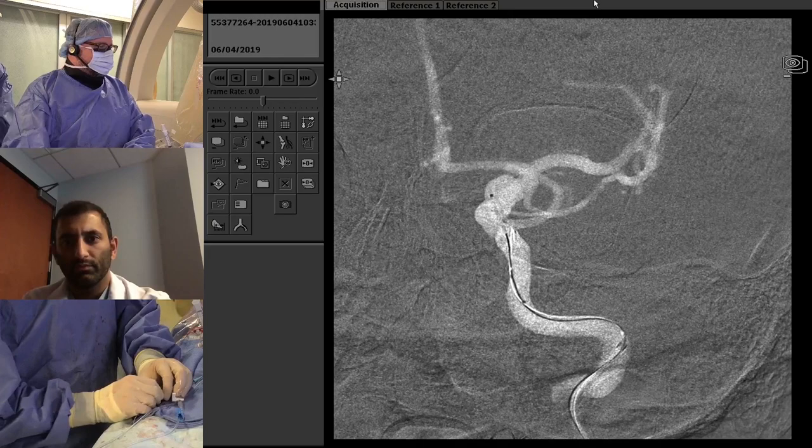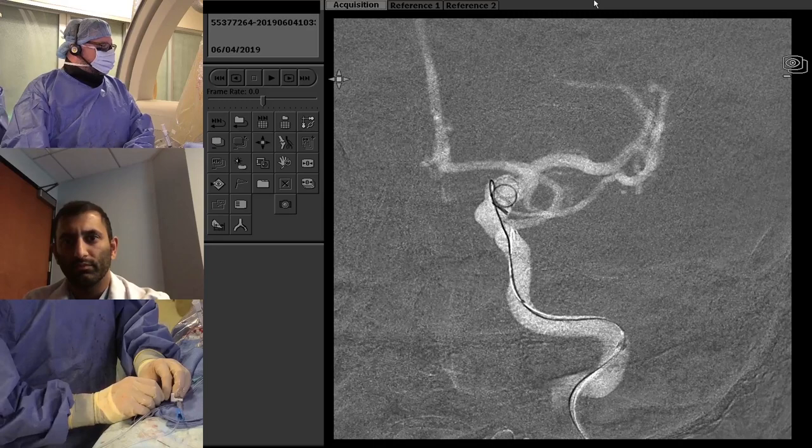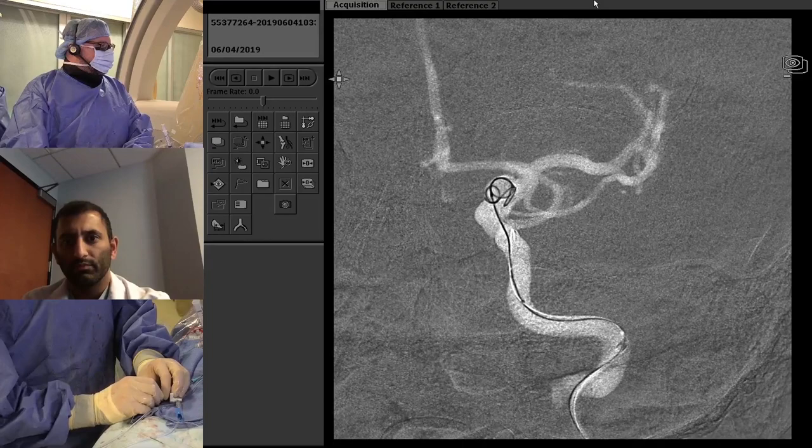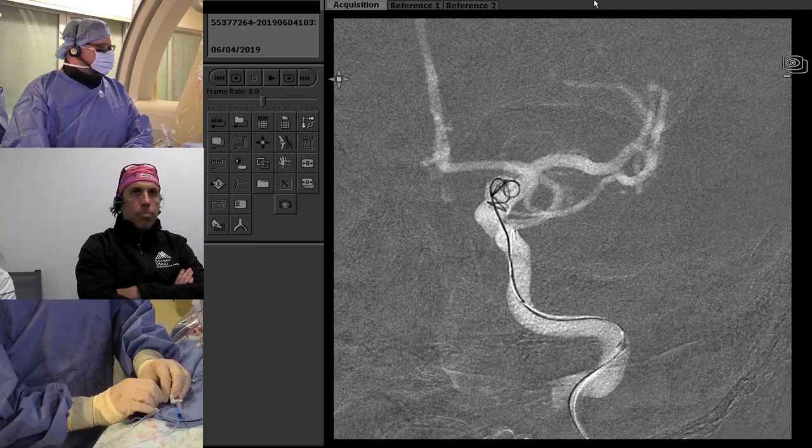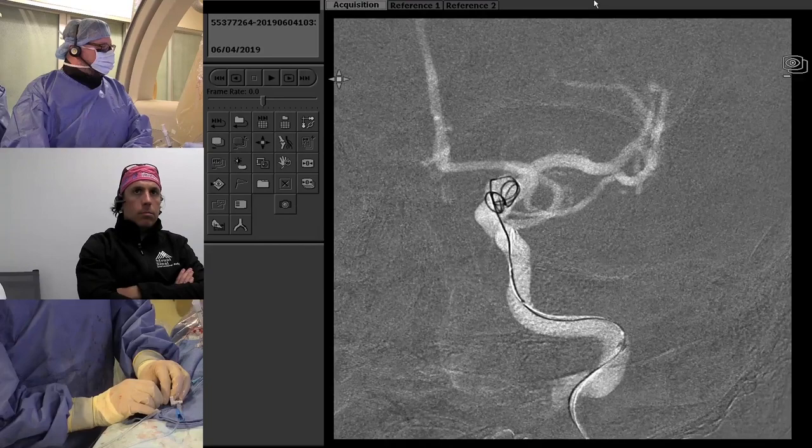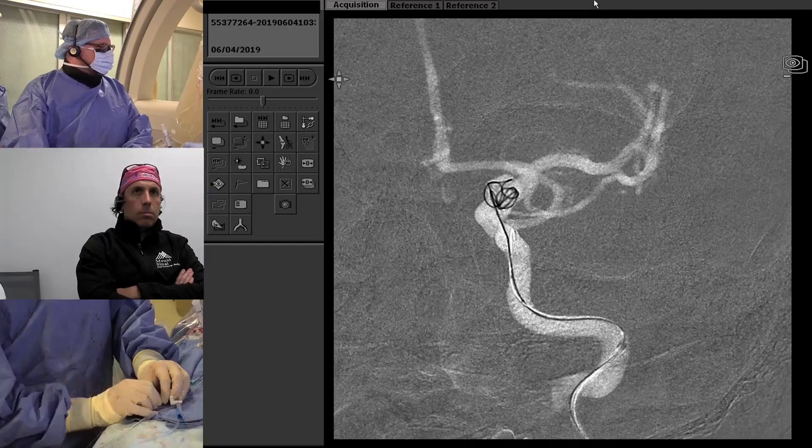You'll see this aneurysm takes a very boxy shape — even wanting to go down by the neck. There we go, now it's set. I'm putting in just this one coil because it's 17 centimeters in length and I feel that gives adequate coverage without trouble. I really don't want it that close to the neck, so I'm repositioning a little bit here.